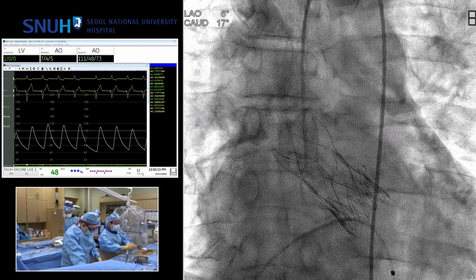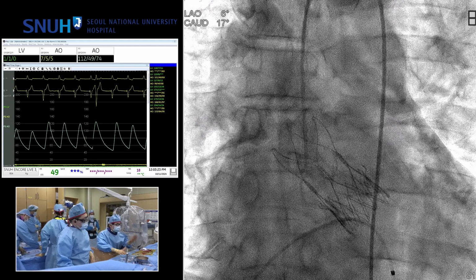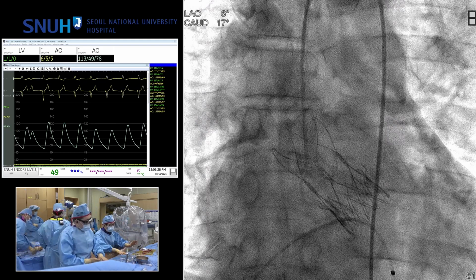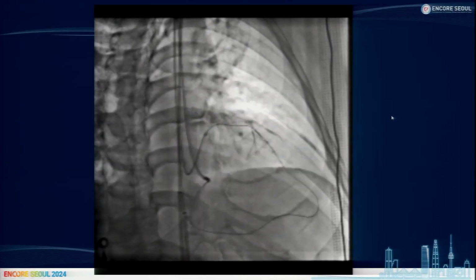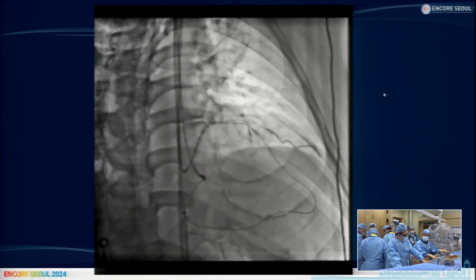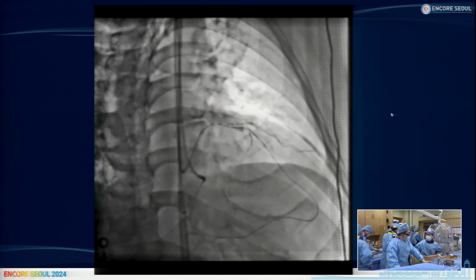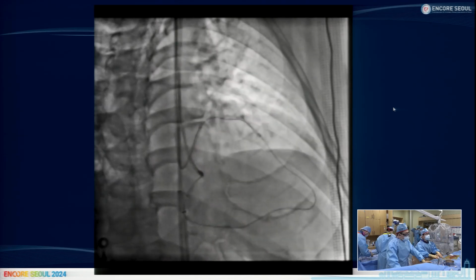Everybody expects. Okay, then I will show you the 10 minutes live additionally. Actually, I'd like to show you my first CTO case that is successfully ended, but you probably don't know the story of my first CTO case. Okay, good. That's to show that coronary angio is better for this panel. Okay, being prepared for the angiography, I will show you the CTO case.